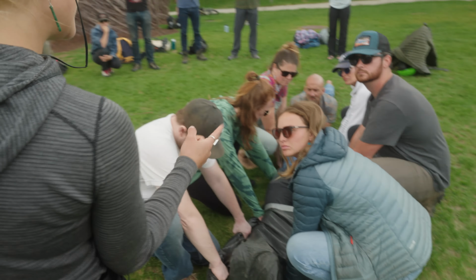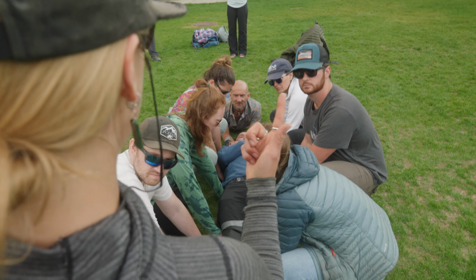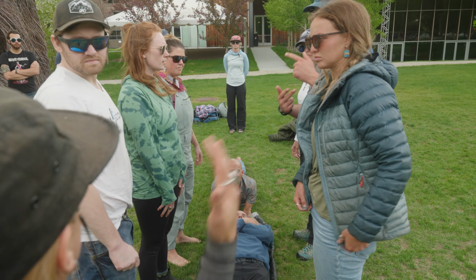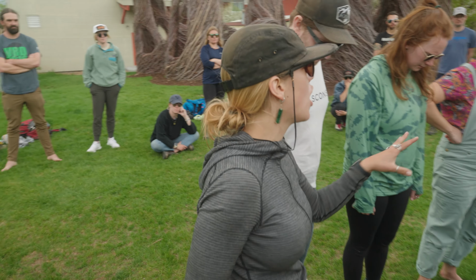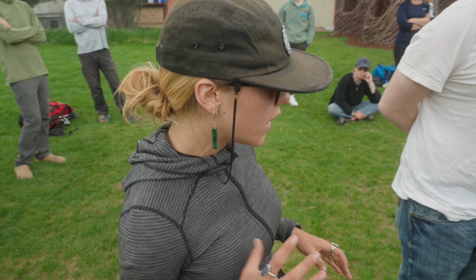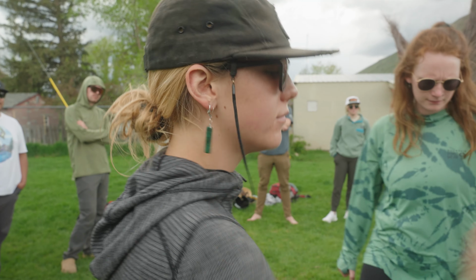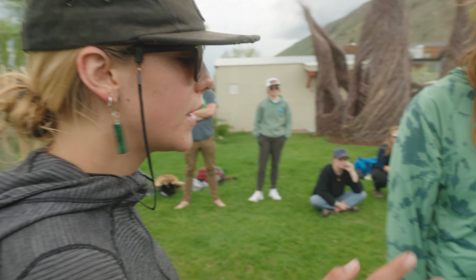Now, before you guys stand up with the patient, everybody let go and stand up. Now, what do we want to think about here? Height. Same time. Yes, so height as well as strength. Where do we want the tallest, strongest people? Yeah, up towards the head. The torso is going to be the majority of the weight, so we want the stronger, taller people to be at the head. So we're going to rearrange like that, okay?